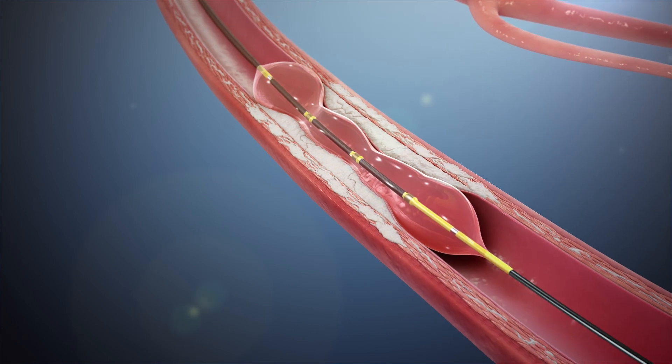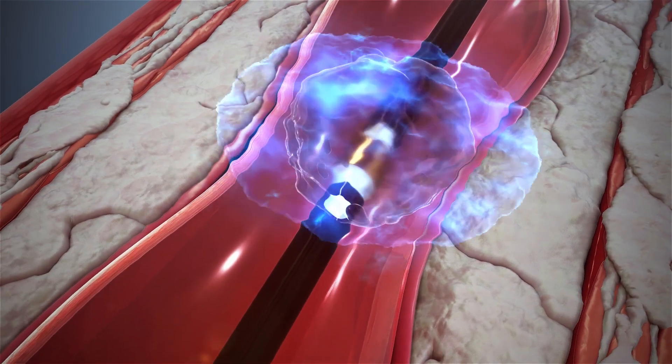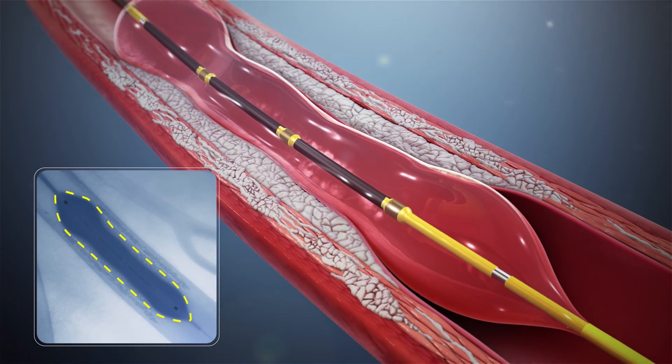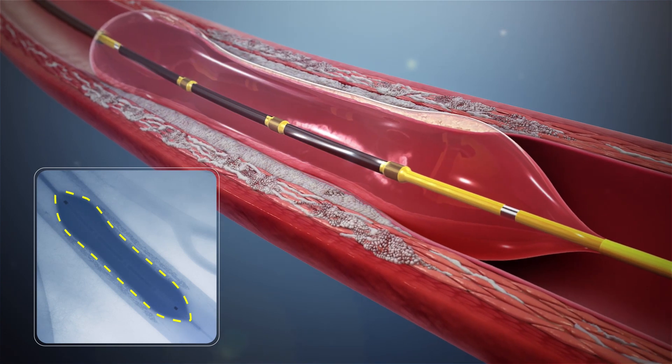The nice part about the lithotripsy balloon is that it uses shock waves to disturb the calcium, not the pressure and the size of the balloon. So you can inflate a balloon at a lower pressure and not cause arterial wall or stretch injury.